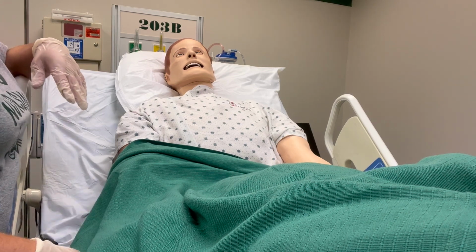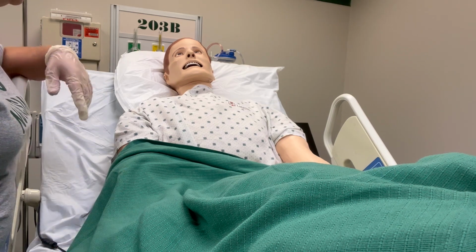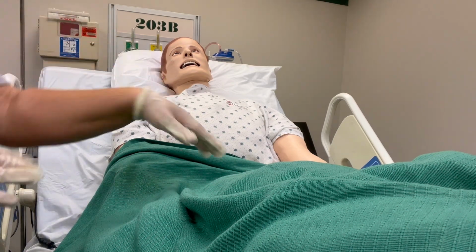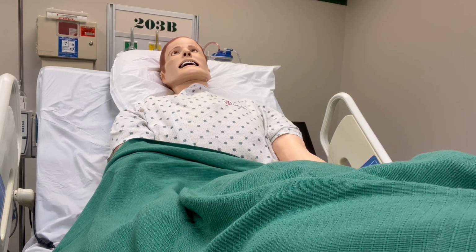I have my students here with me again. Do you mind if they come in and I kind of walk them through this as I'm doing it? No. Perfect. I appreciate that. All right. So wash my hands. I've put on my gloves. I've ID'd Mr. Smith. I'm going to go ahead and do my medication checks.